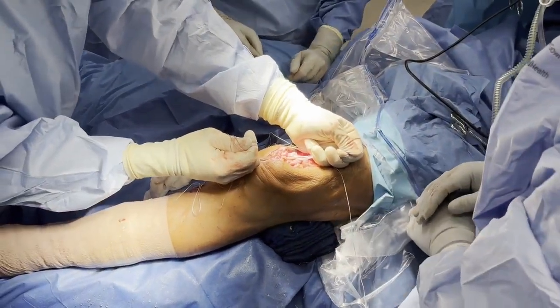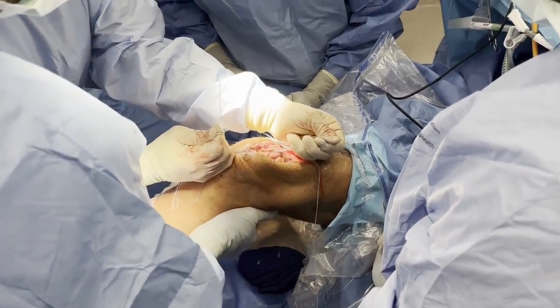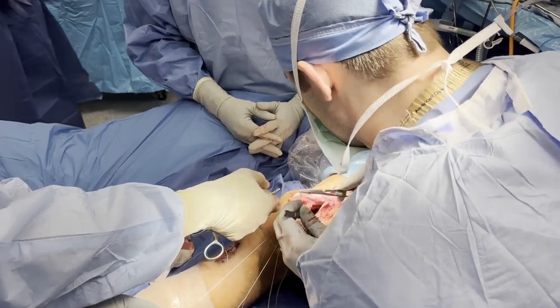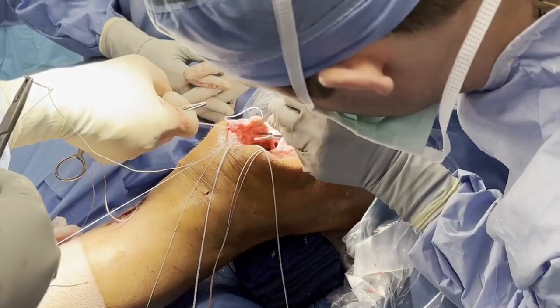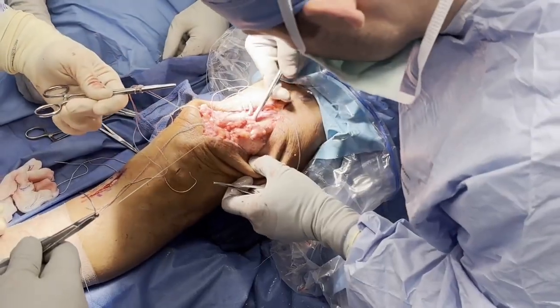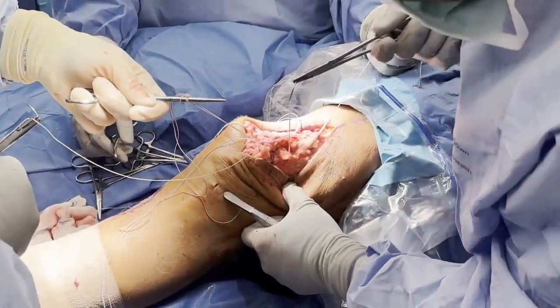The medial and lateral quadriceps tendon tag sutures are tensioned in a crossover fashion to evaluate the quadriceps tendon for proper approximation and defect coverage. Two Q-fix anchors are sutured with a running locking stitch into the medial quadriceps tendon flap, and another similarly into the lateral quadriceps tendon flap, all located at their respective approximating borders.